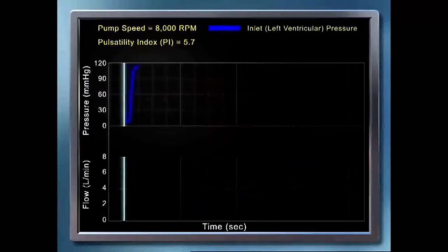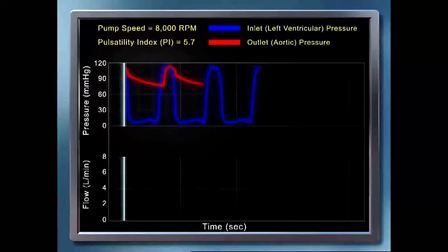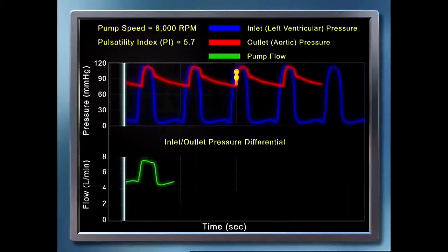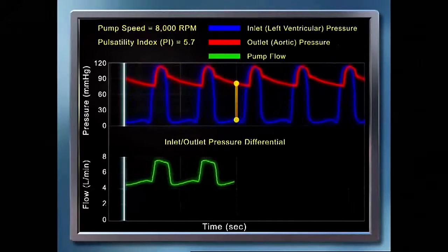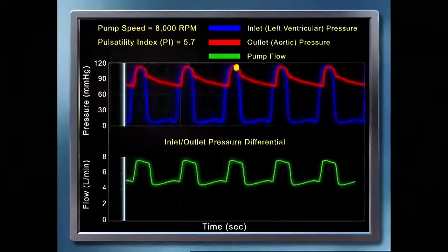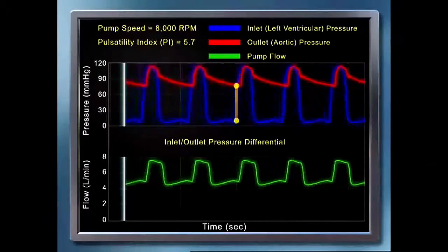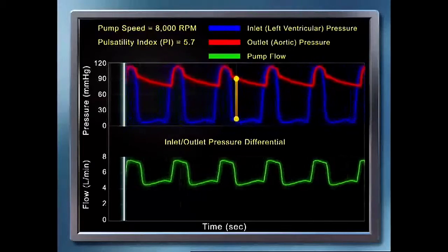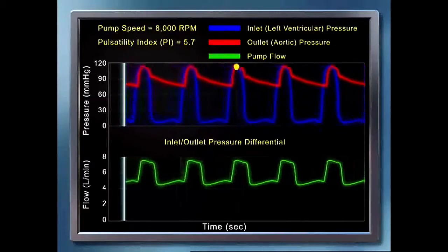The simulated monitor tracings show the ventricular and aortic pressures of a patient. The blue waveform represents the pressure at the pump inlet, which is the left ventricular or LV pressure. The red waveform represents the pressure at the pump outlet, which is the aortic pressure. The difference between these two pressures, indicated by the vertical yellow bar, is the pressure difference across the pump.